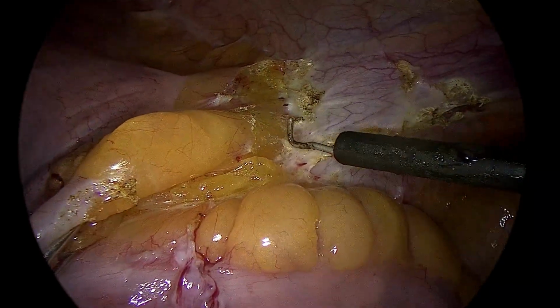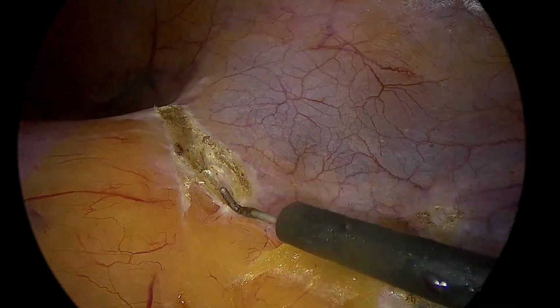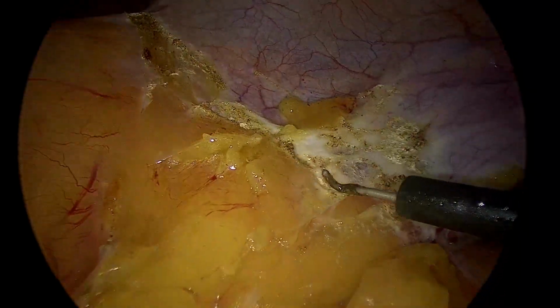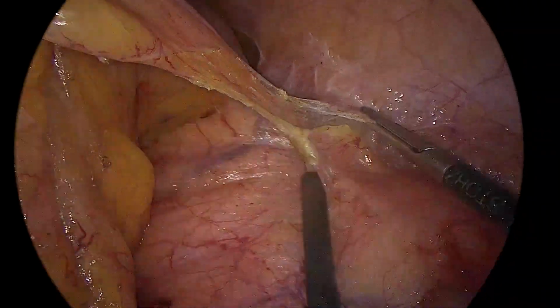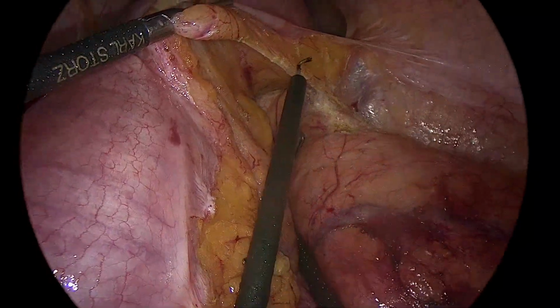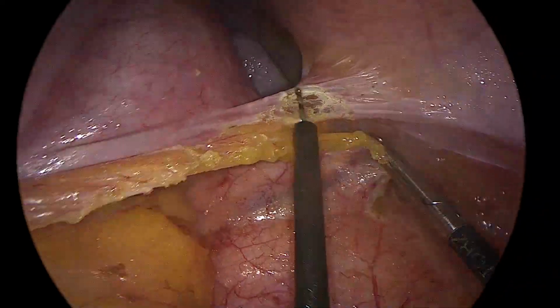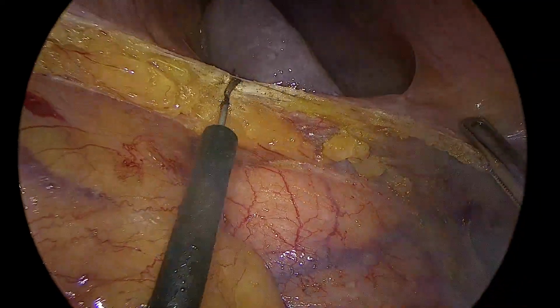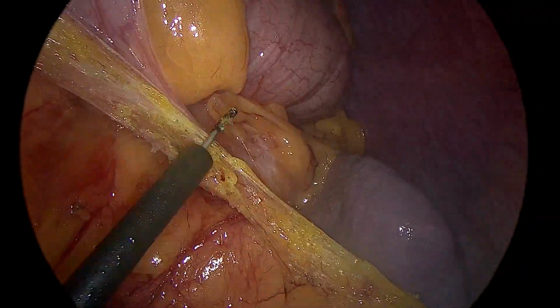Now here as you can see we are doing lateral to medial mobilization of descending and transverse colon, and after that we did splenic flexure mobilization, and after mobilization was completed we moved to the total mesorectal dissection and hemostasis is secured along the way. Dissection and mobilization of splenic flexure and transverse colon done with cautery.